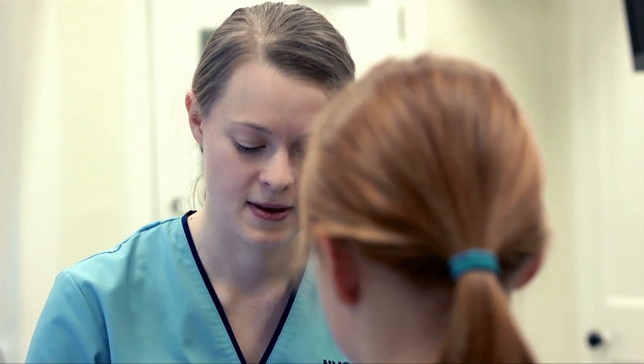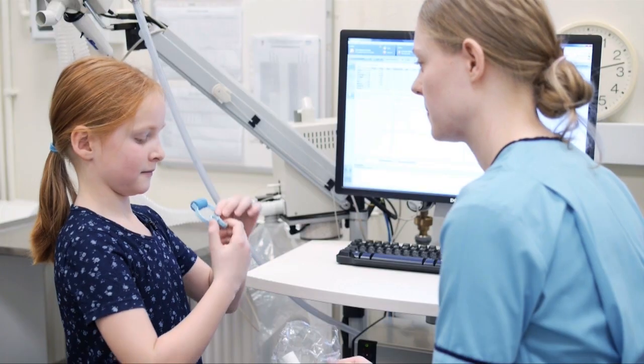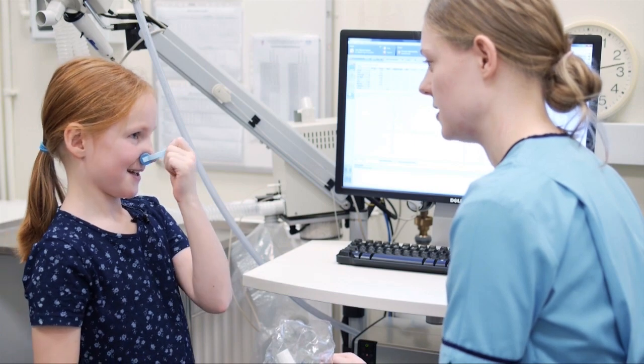Would you like to try the nose pegs now? If you squeeze the top bit then you can put that bit on your nose. We'll just get them pointing up so you don't bang your nose when you go onto the mouthpiece. And we get people to wear nose pegs so that all the air goes into the machine and none of it escapes out into the room.